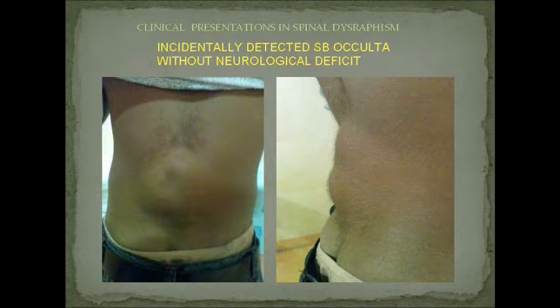And at this stage, whether one does a full urinary workup in these. He had no symptoms. So whether we should do a urodynamics in such patients as a baseline urodynamics is a question which comes to my mind.